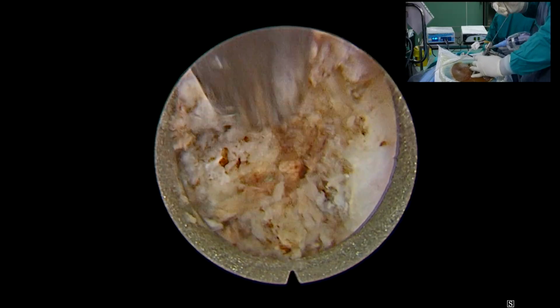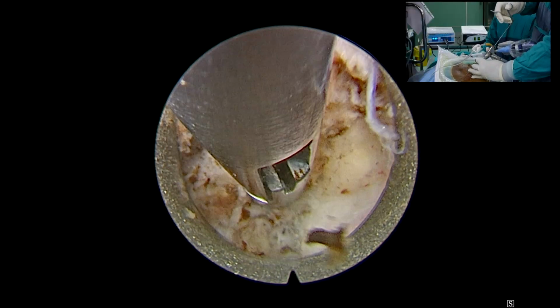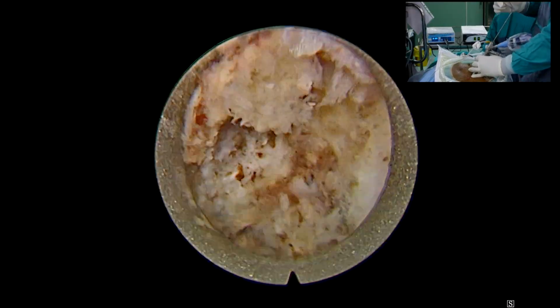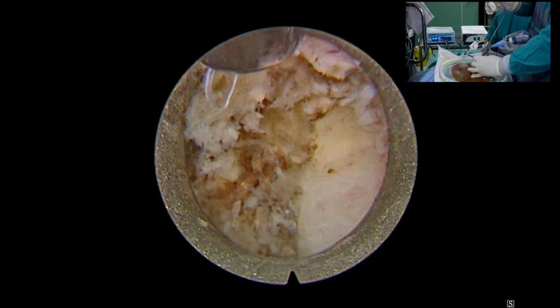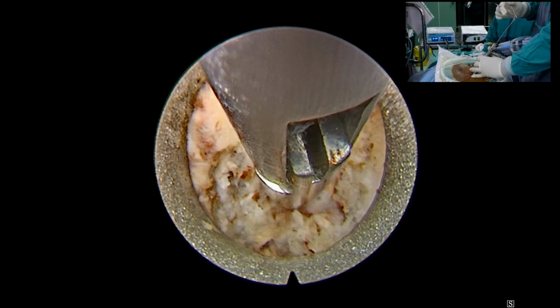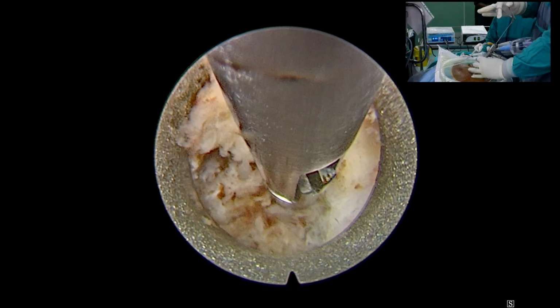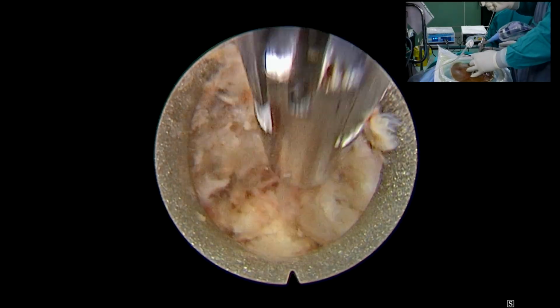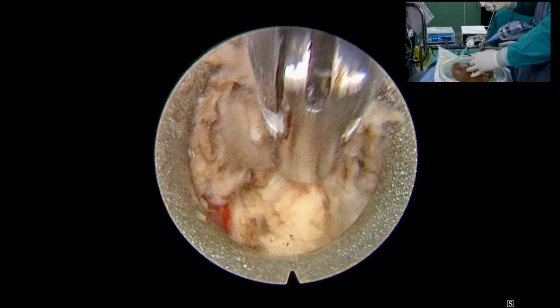So this is the only interlaminar space which Dr. Shubhendu is palpating. That is the lower lamina, that is the upper lamina. So we will make a larger window over here with great effort of Dr. Shubhendu.